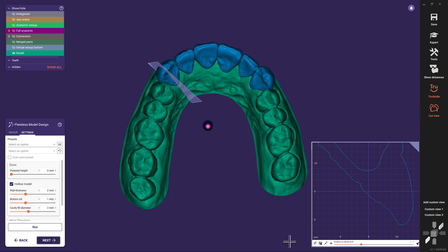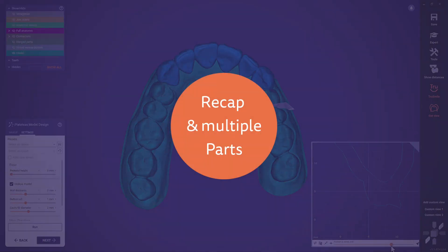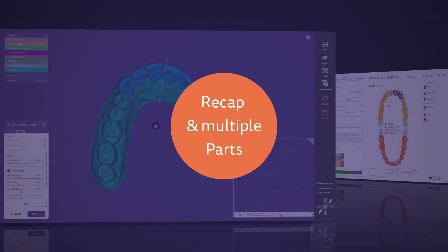After the calculation is done, we can have a look inside our model. Both meshes have been merged into a single and watertight mesh. Now you have seen how fast and easy it is to create a mockup model. Also, you have the freedom of choice to add all the parts from your design journey to the model.